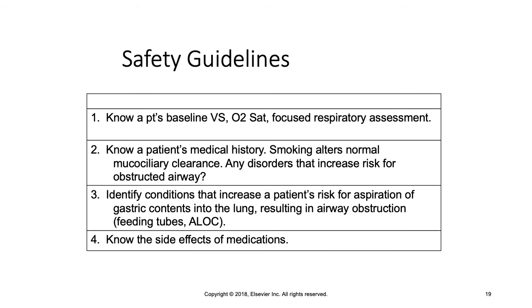Safety guidelines. You want to know where your patient is starting out. So baseline vital signs, baseline focused respiratory assessment, and O2 sat, so that when you go in later and assess your patient, you'll know if there are changes, you'll know if they need to be suctioned or if their condition is improving. You want to know your patient's past medical history.